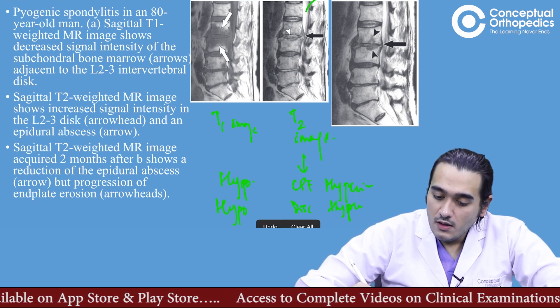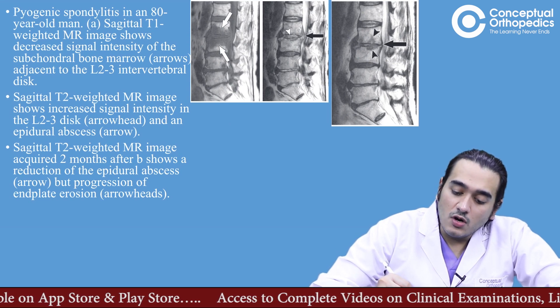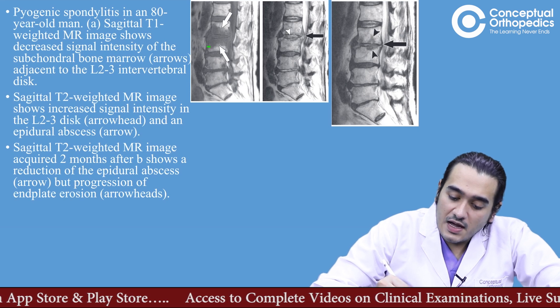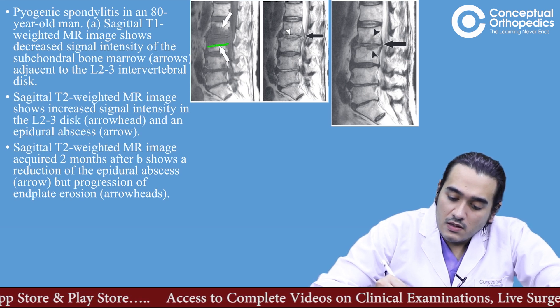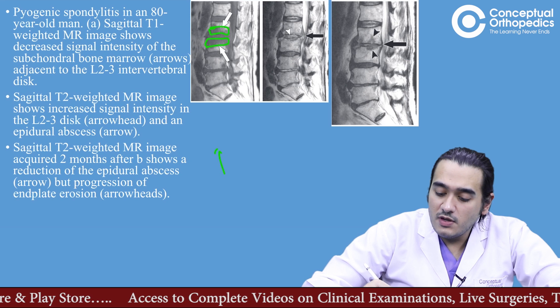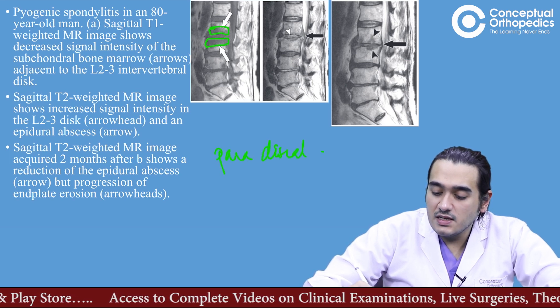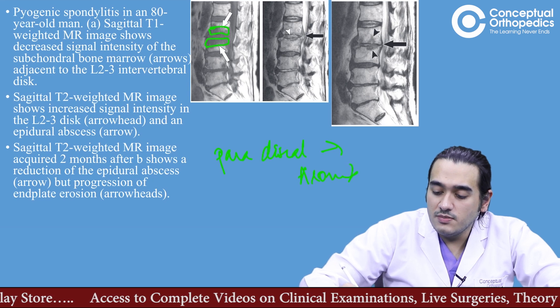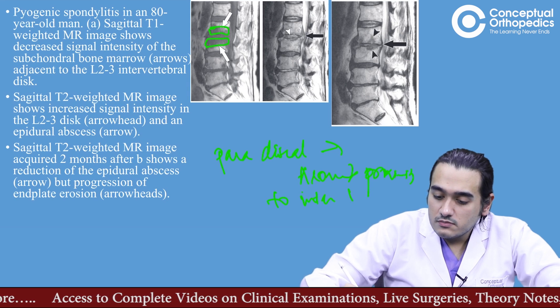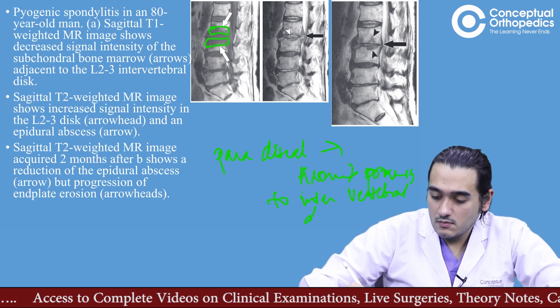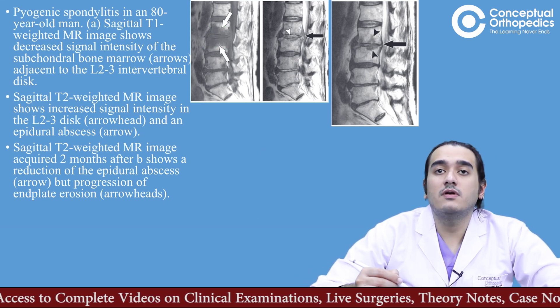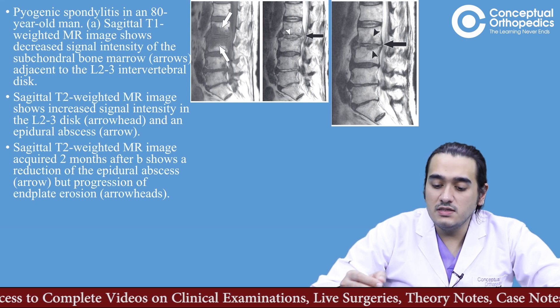When we see this MRI and look at the pathological level, there is hypointensity in the area of subchondral bone in the paradiscal space. The paradiscal area is basically the area which is around or in proximity to the intervertebral disc. The most common sign that tells you it is an infection is having this kind of hypointensity on the T1 image.